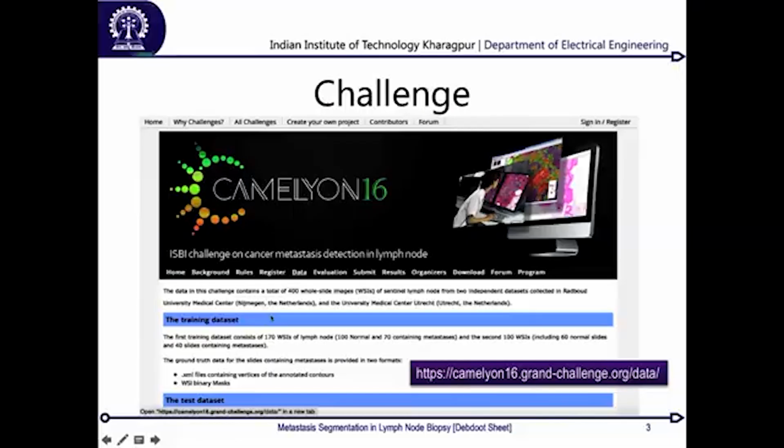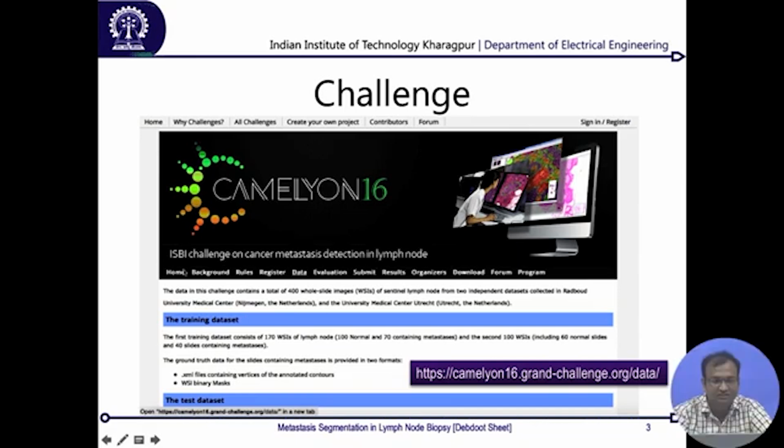So the challenge is called CAMELYON, and if you look over here, the banner says it's an ISBI challenge on cancer metastasis detection in lymph nodes. You can definitely go to this URL, and this year it's camelyon17.grand-challenge.org. So the new version is already up and running. At the time when you are listening to these lectures, it's hopefully still accepting submissions.